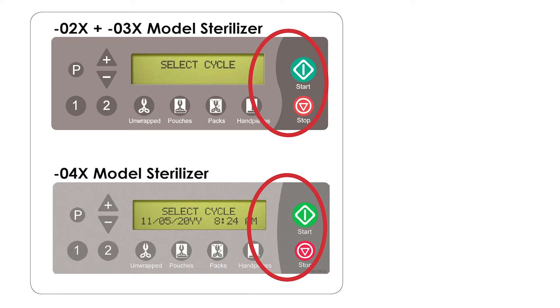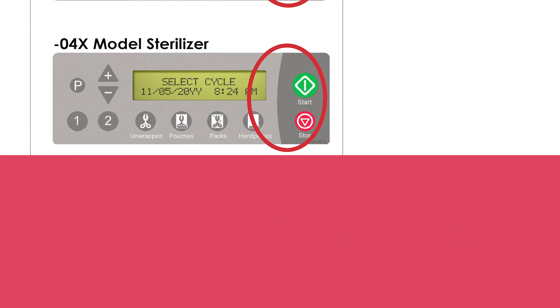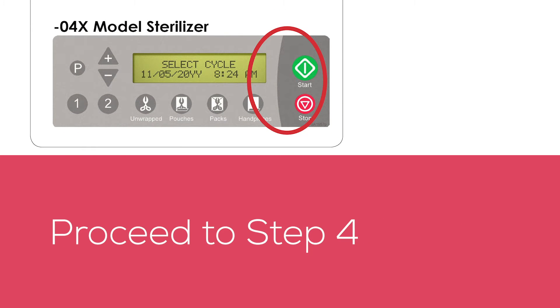If you have a 02X or 03X model sterilizer, consult the data logger user manual for further installation instructions. If you have a 04X model sterilizer, proceed to step 4.